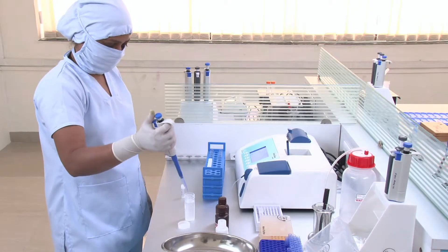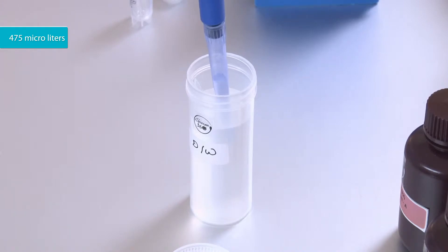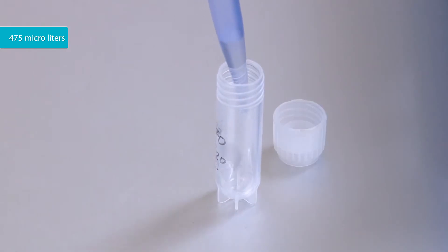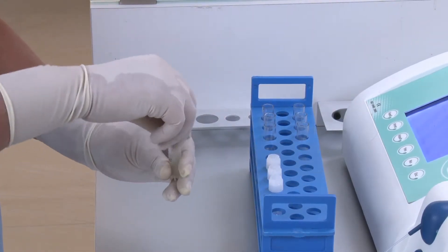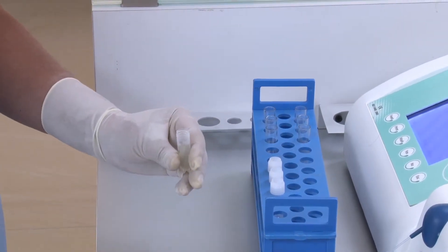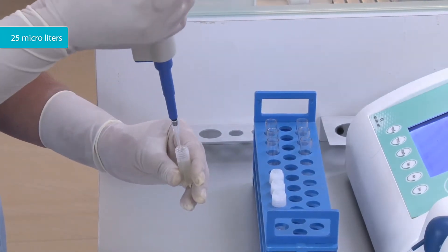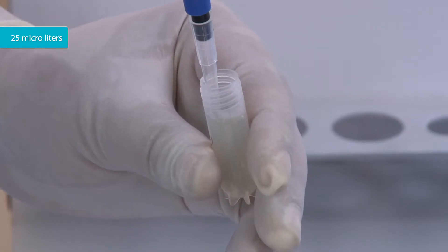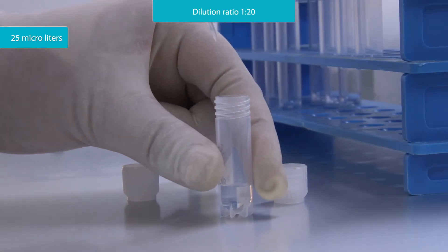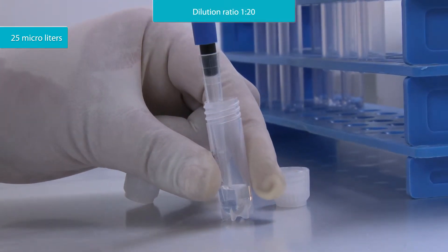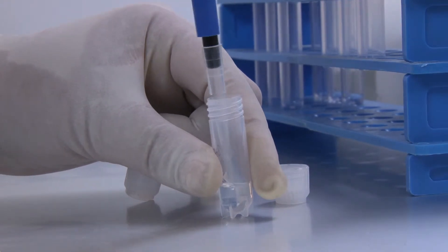Put 475 microliters of normal saline into the microtube. Add 25 microliters of seminal plasma to the microtube. Hence the dilution is 1 to 20. Mix it well.